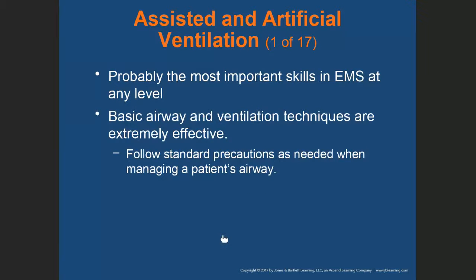Now, assisted and artificial ventilation. So we have looked at the supplemental devices: your nasal cannula, your partial rebreather, your non-rebreather, your Venturi mask, your tracheostomy mask. Now let's look at positive pressure ventilation devices. So you have a term that is referred to as assisted ventilation, and you have artificial ventilation. Whether you see the term assisted or artificial ventilation, it is referring to positive pressure ventilation. Let me repeat that. Whether you see the term assisted or artificial ventilation, both terms are the same when we use the term positive pressure ventilation.